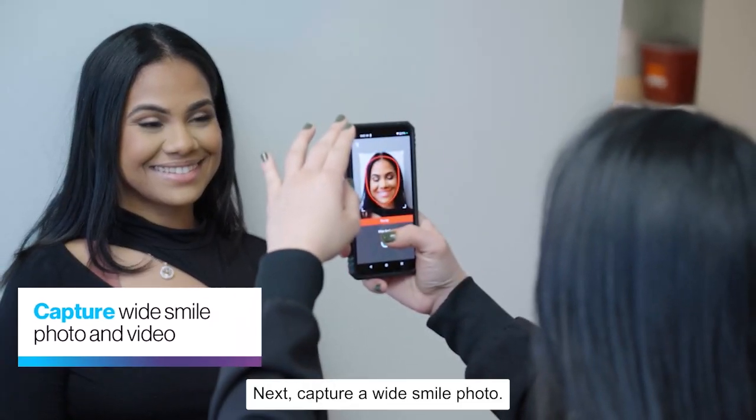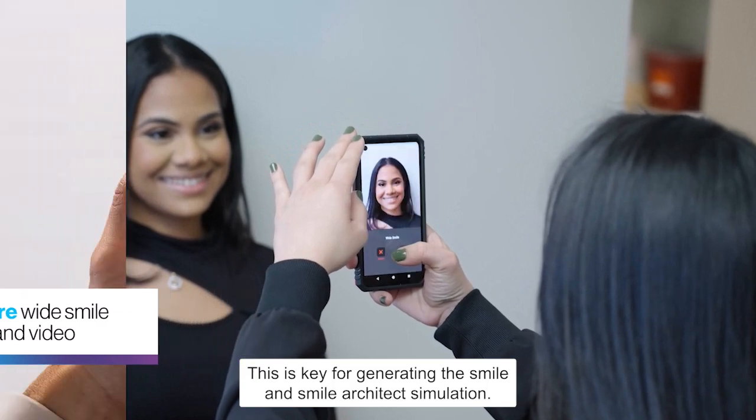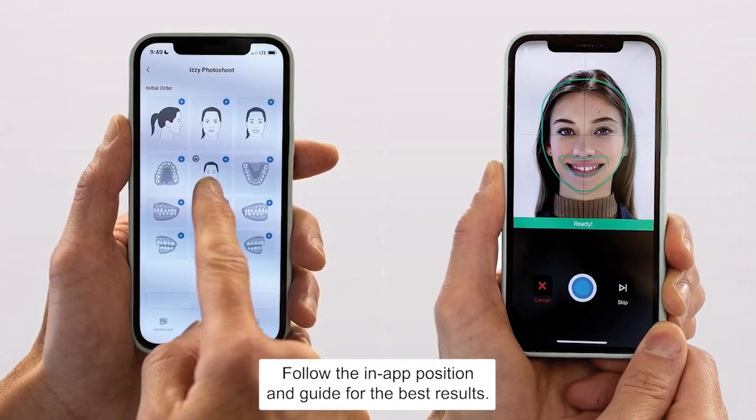Next, capture a wide smile photo. This is key for generating the Smile and Smile Architect simulation. Follow the in-app positioning guide for the best results.